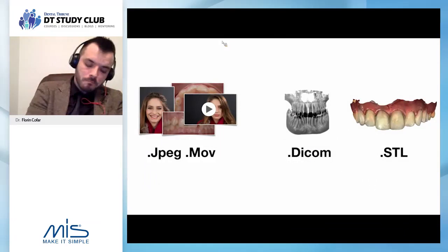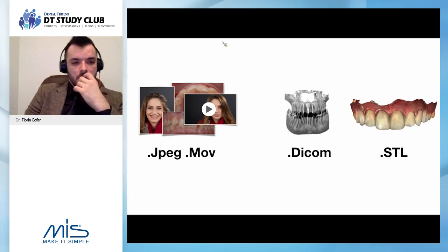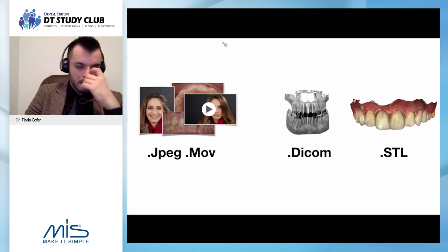And now let's have an overview of what digital dentistry is today. First of all, one of the things that has changed is the way that we do consultation. Consultation in an analog way used to always be more or less the same thing. You have a visit, you have some chat with the patient, you have a consultation kit.